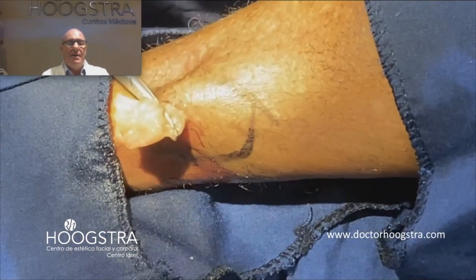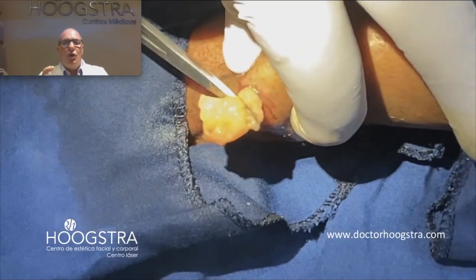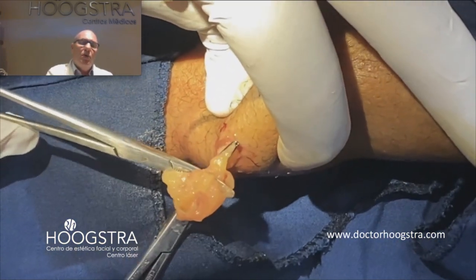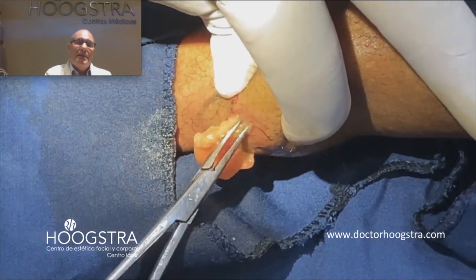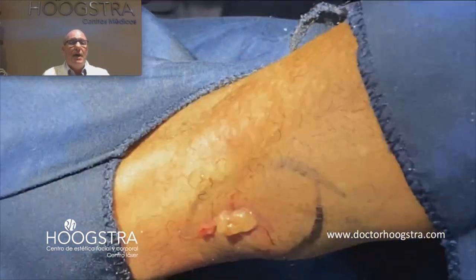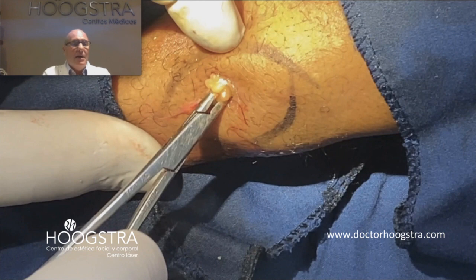Like you are going to see here — softly pulling and softly squeezing — I can remove all the lipoma. And the interesting thing is I don't cut the tissue. I don't coagulate the tissue. Just pulling and squeezing.